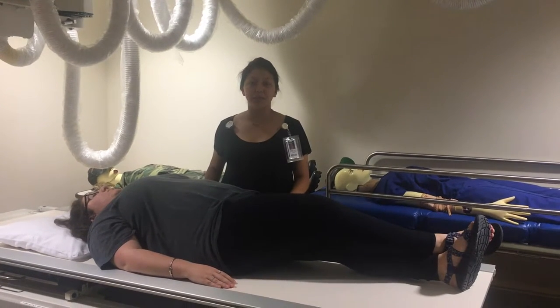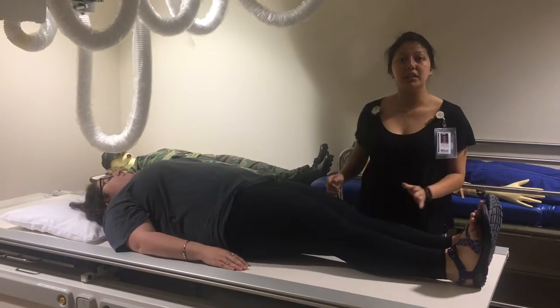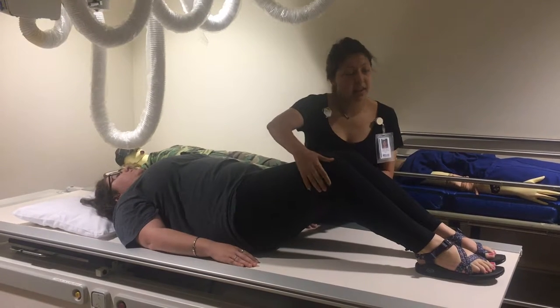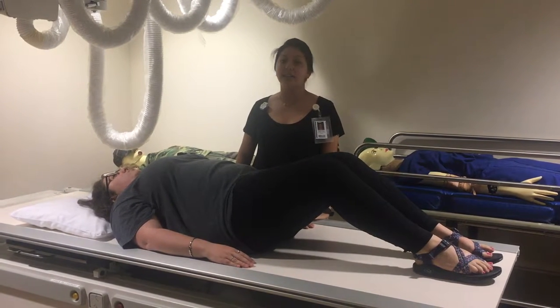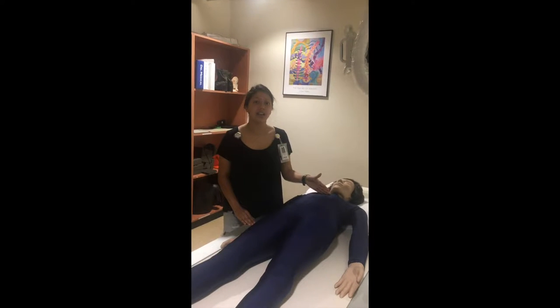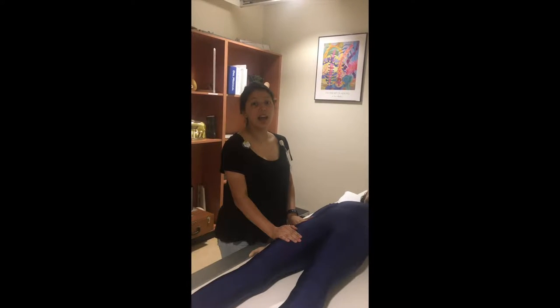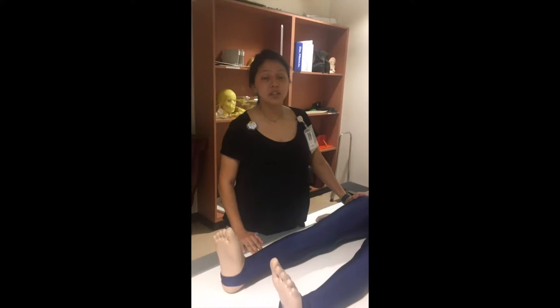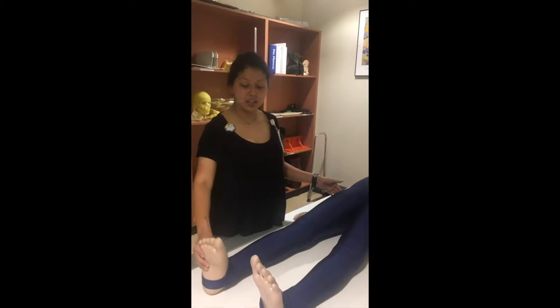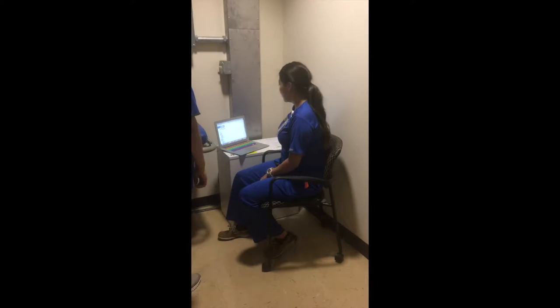Correct positioning for an AP lumbar spine: you have to make sure that your patients don't have their legs crossed. A really good thing to decrease your magnification on your image is to flex the knees just a little bit. That puts your spine closer to the IR, so you decrease OID. Some landmarks that a technologist should know: the xiphoid process is at T9 and T10, your iliac crest should be at L4 and L5, and your ASIS should be at S1 and S2. Another important landmark is the greater trochanter — rotating the patients in and out should put you at the level of the pubic symphysis.